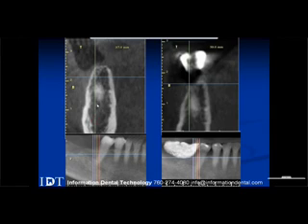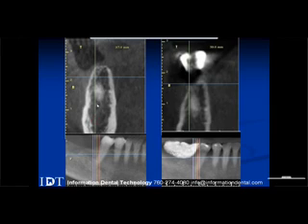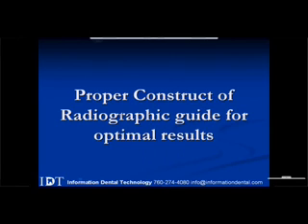We're going to see the canal and be able to trace it really well. The medullary bone space and the true shape of the crestal bone will be clearly represented in that CT or cone beam scan. The problem is it doesn't satisfy the restorative needs — we can't see the ideal tooth location. So we have one or the other, with no happy medium. We have a technique that allows us to get both the surgical advantage and the restorative advantage, and we do that by building a proper radiographic guide.